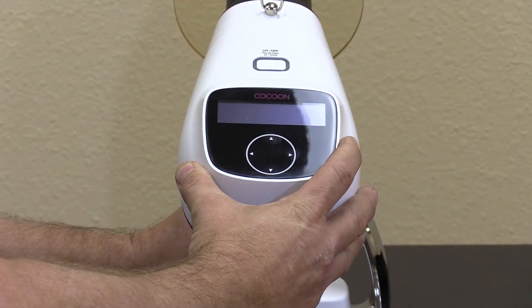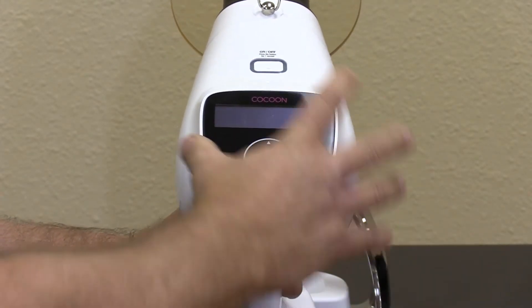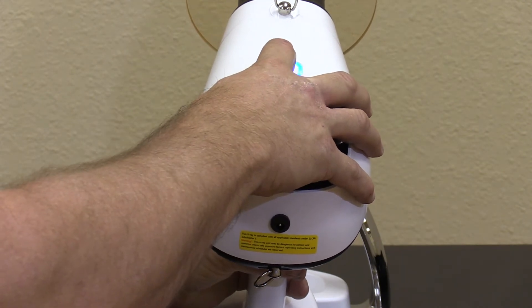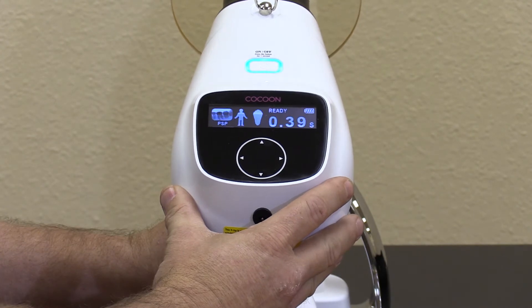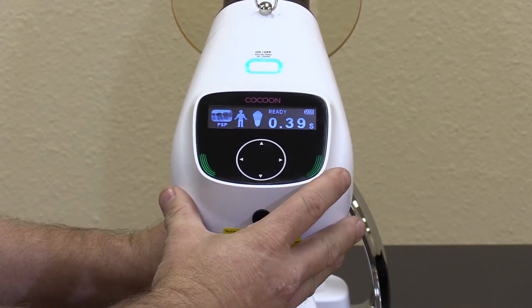Alright, let me show you how to use the new Cocoon. Simply push the start button and hold for one second. Power on. The tube is energized and ready for exposure.